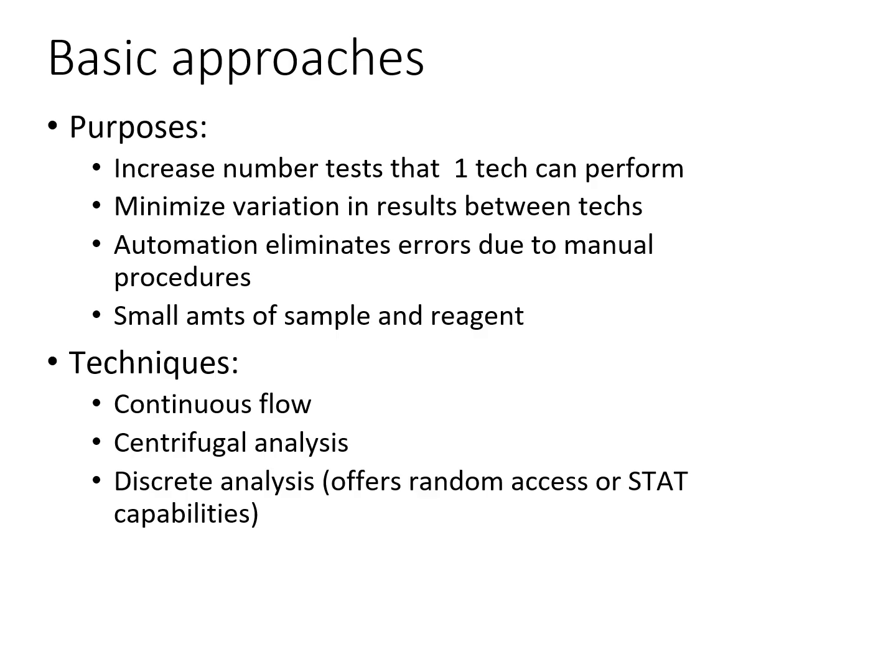So, basic approaches. An introduction. So we got automation in clinical laboratories has revolutionized how diagnostic tests are performed. The goal is to enhance efficiency, accuracy, and throughput while minimizing errors in human intervention.